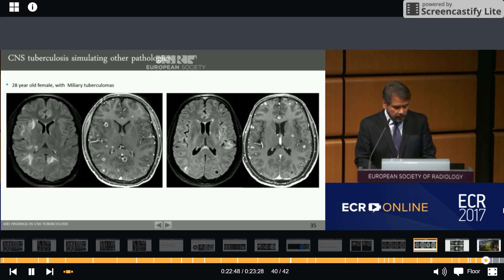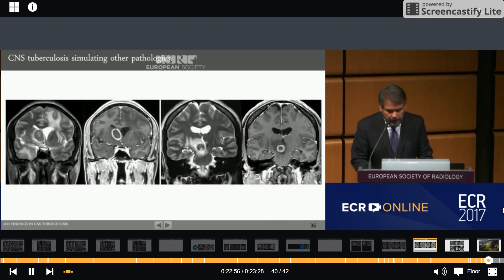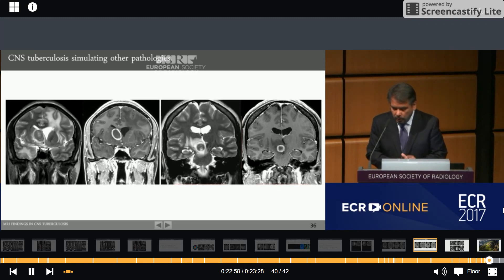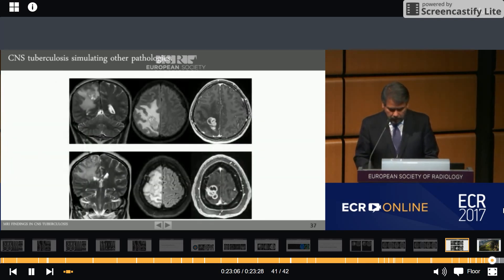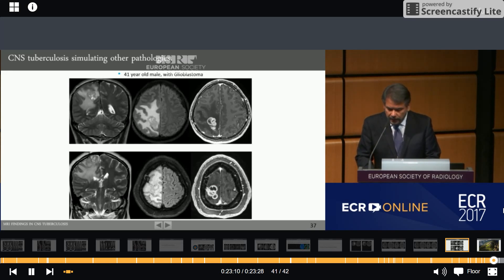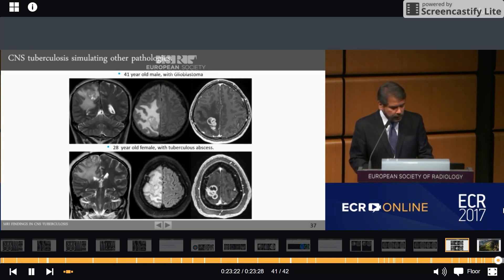The images are very similar. A 28-year-old male with tuberculoma is compared to a 26-year-old female, HIV-positive, with toxoplasmosis. A 41-year-old male with glioblastoma is compared to a 28-year-old female with tuberculosis abscesses. Perfusion sequences can help to differentiate between these entities.